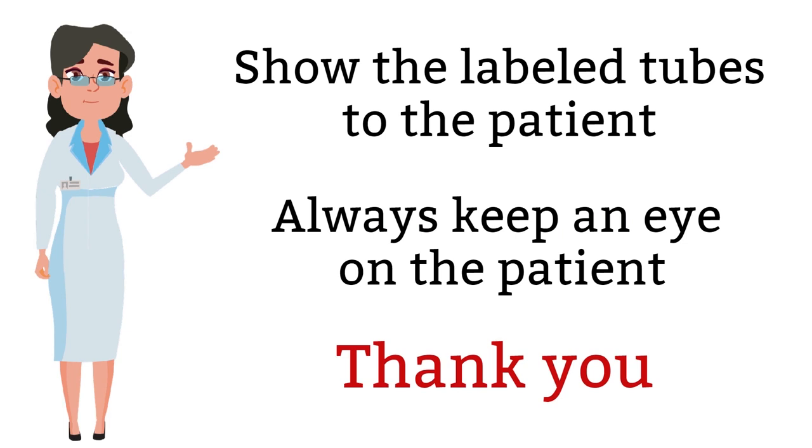Seventeen, you then thank the patient for his or her cooperation and let the patient go.